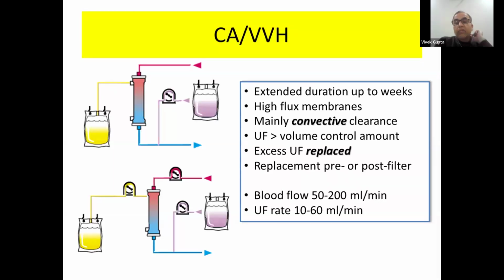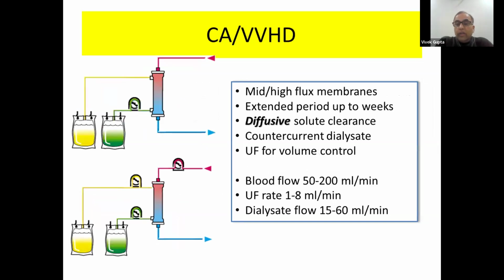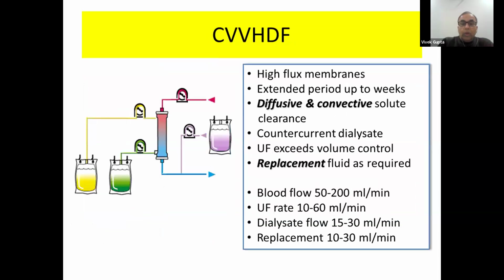CVVH, the main principle is convective clearance through which there is a solvent drag, and we can remove the middle molecules with the use of a replacement fluid. Whatever amount of fluid is coming out, we are replacing it. CVVHD is based on diffusion. That is the normal routine principle of any of the dialytic modalities, where we use a dialysate which moves in the countercurrent direction of the blood flow, and we take out small molecules in the form of urea, creatinine, or other smaller molecules.